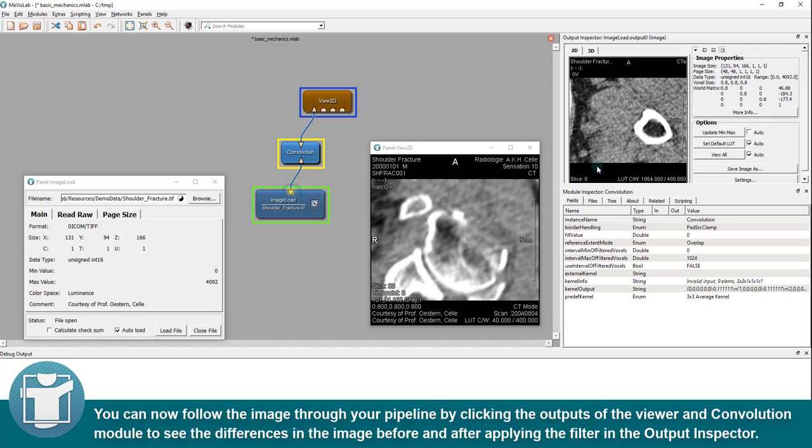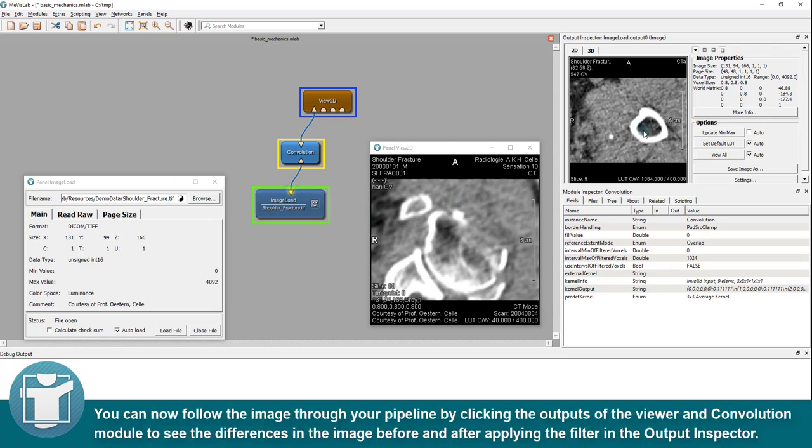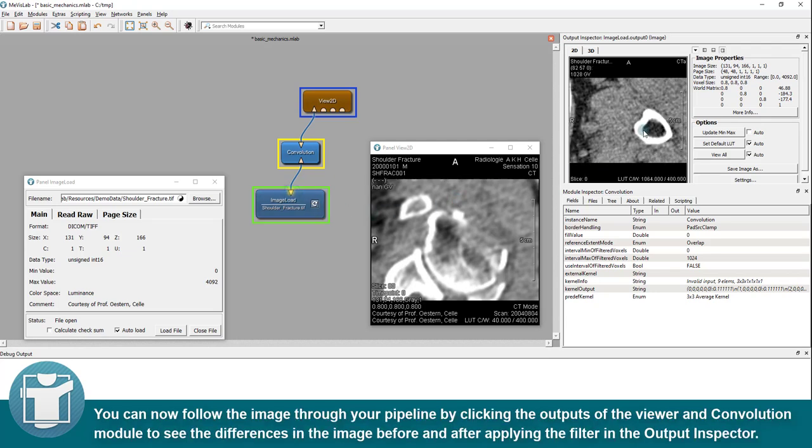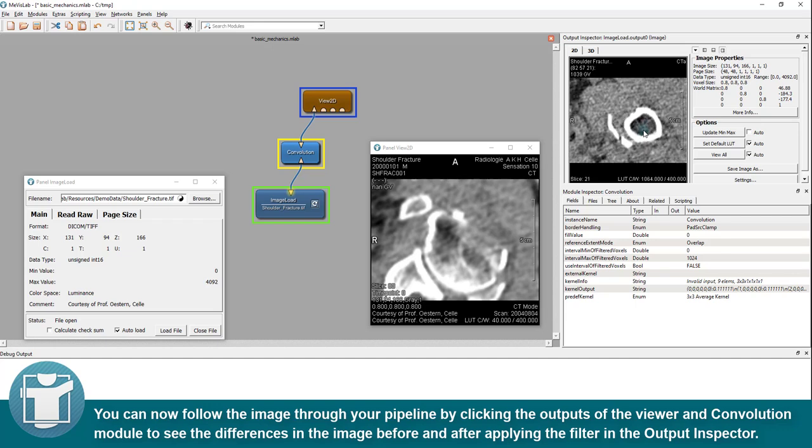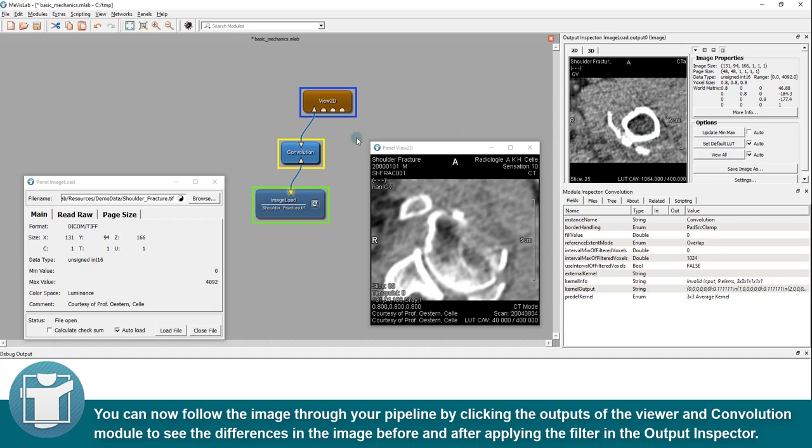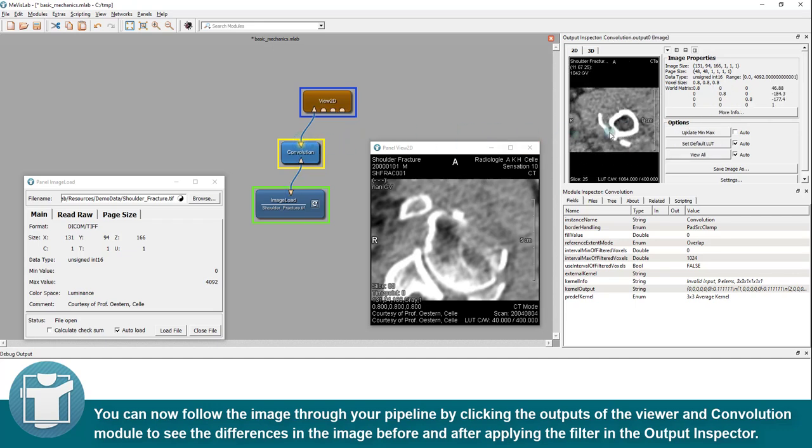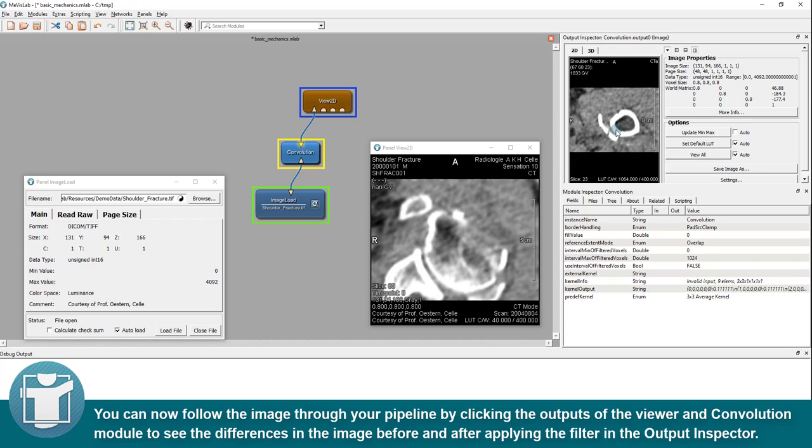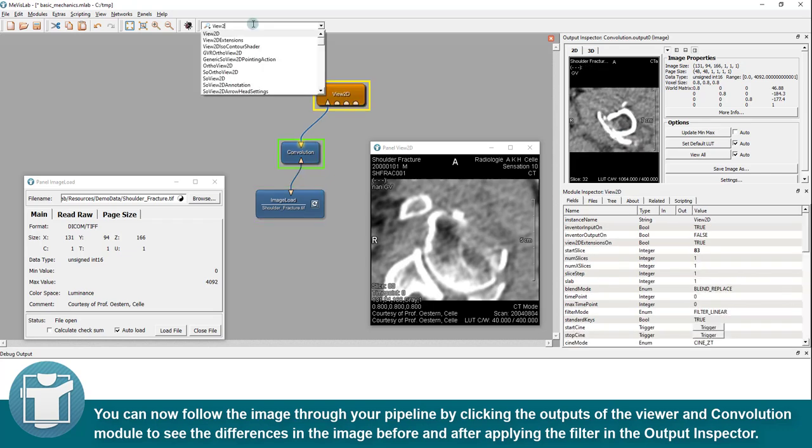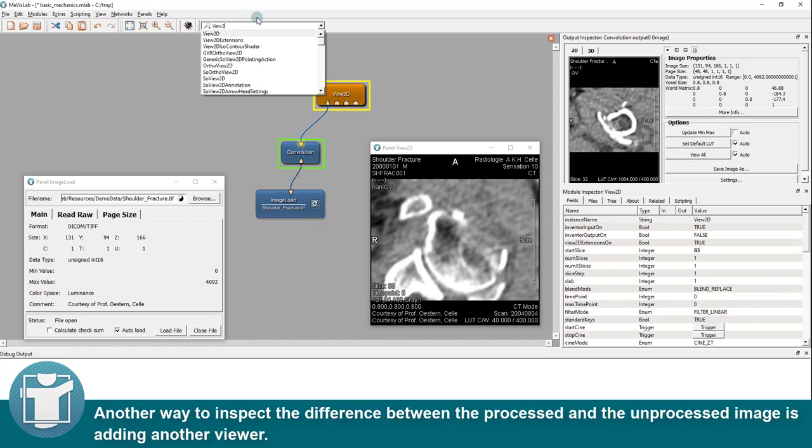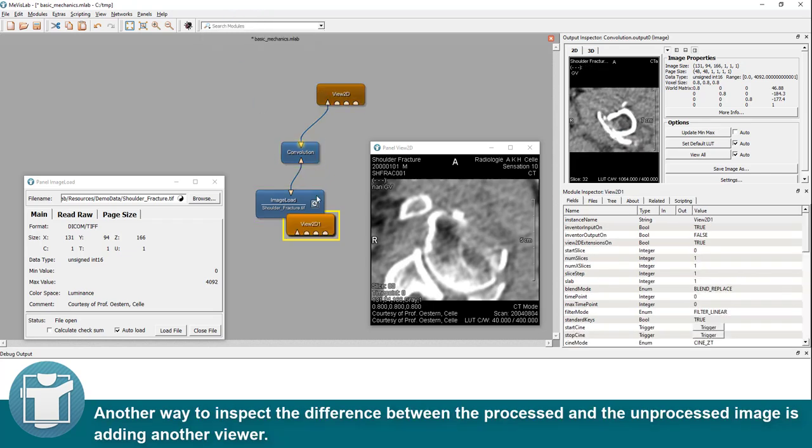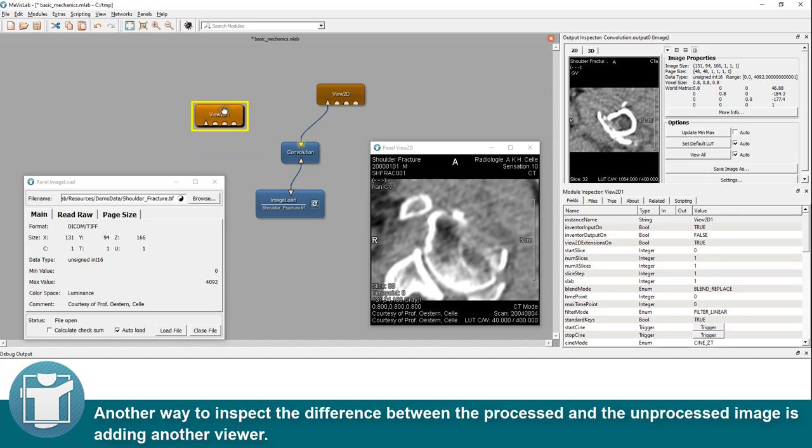You can now follow the image through your pipeline by clicking the outputs of the viewer and convolution module to see the differences in the image before and after applying the filter in the output inspector. Another way to inspect the difference between the processed and the unprocessed image is adding another viewer.